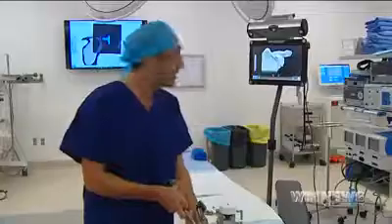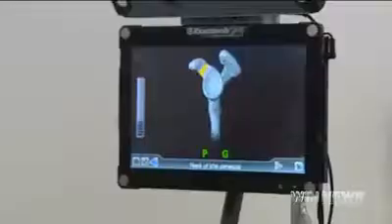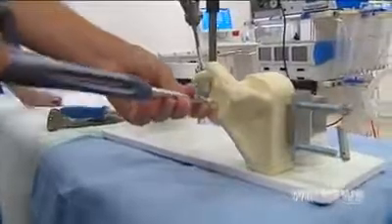She's one of just 36 people who's gone under the knife for this groundbreaking navigational surgery, which uses pinpoint accuracy. It's the same operation we've been doing for 10 years. There's no different implants, there's no different technique. It's just we're doing what we always do, but we're getting this constant feedback to make sure we get 100% accuracy.